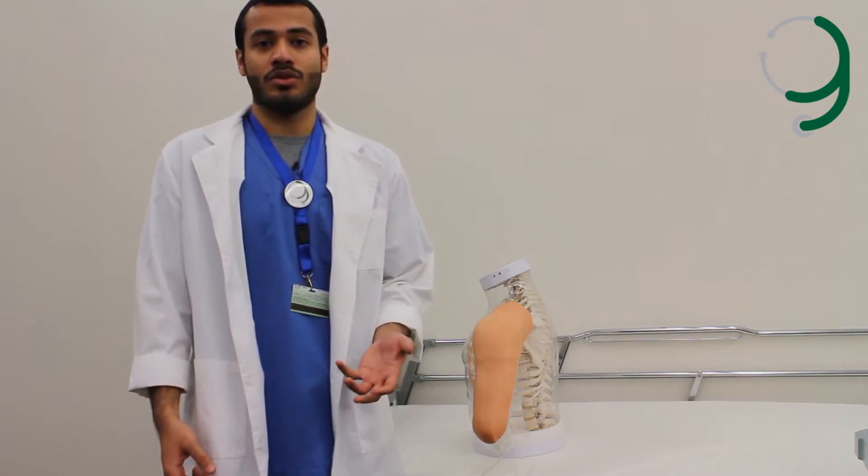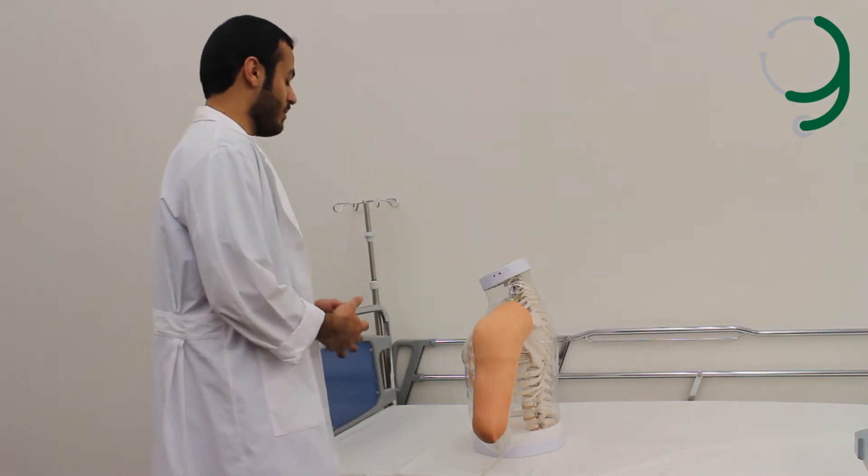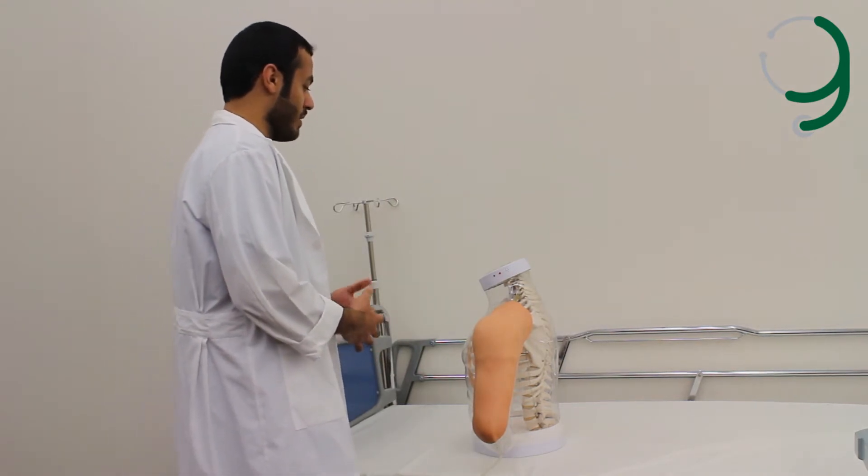We'll begin with checking the doctor's order and checking the patient's name and age. Good morning, my name is Abdullah Al-Adil, I'm a medical student. Can I have your name and age, please?